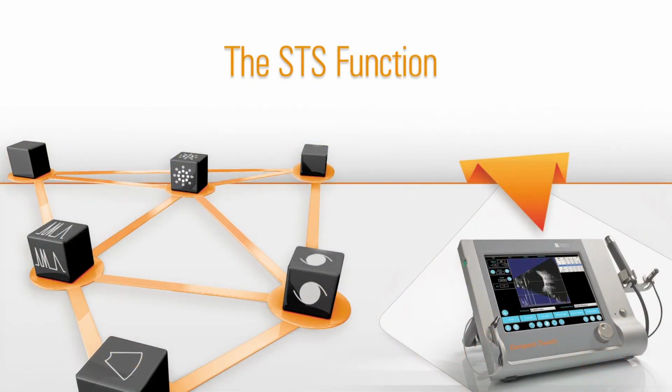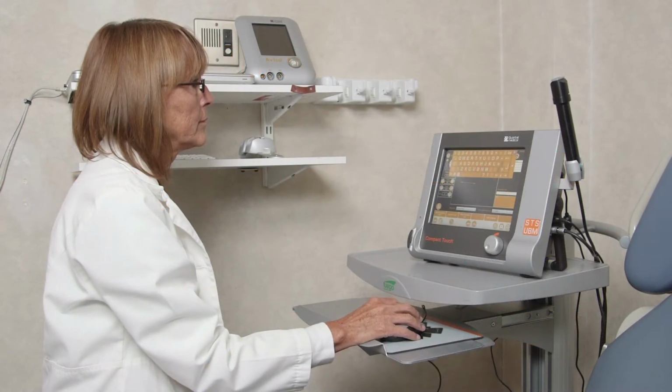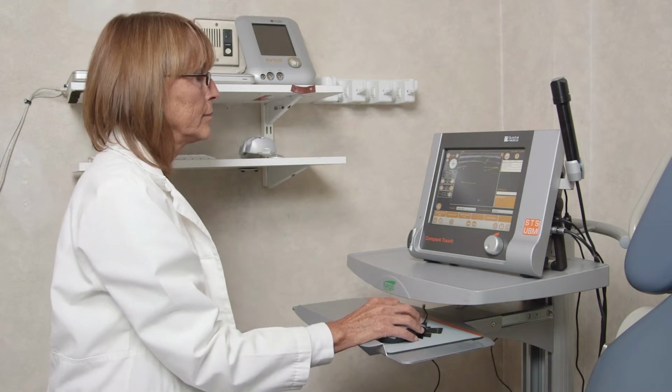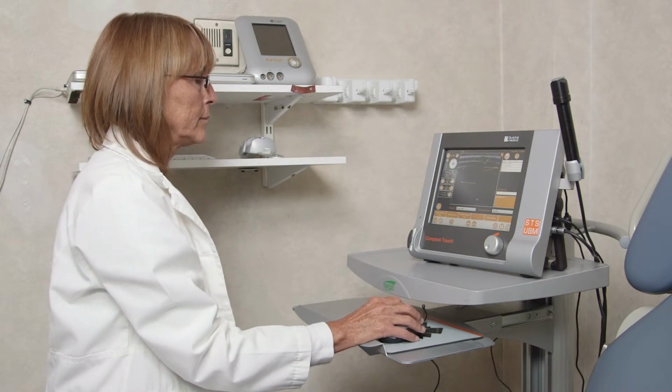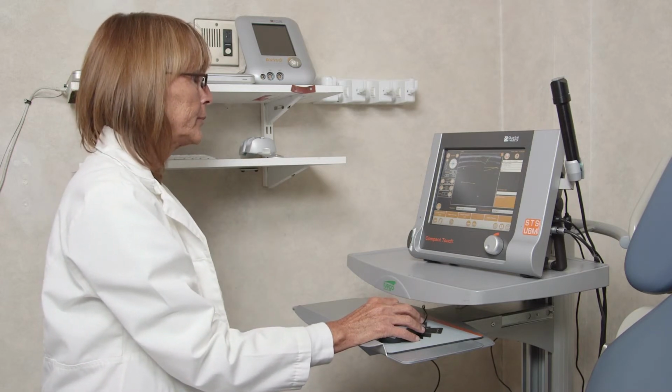The STS function. The Compact Touch STS UBM allows surgeons to take automatic measurements of sulcus-to-sulcus distances to select the most suitable posterior chamber phakic IOL or implantable contact lens. The software enables sizing of the lens and simulation of its placement between the sulcuses.